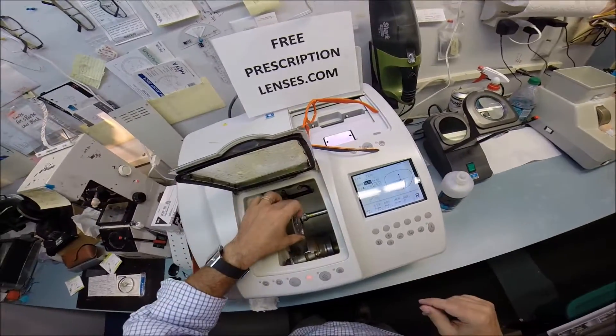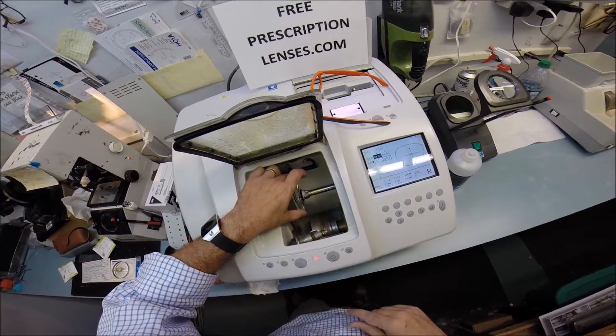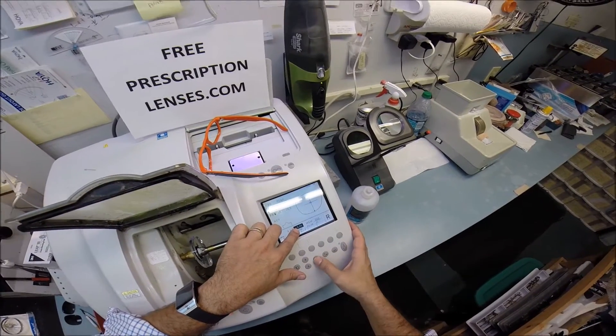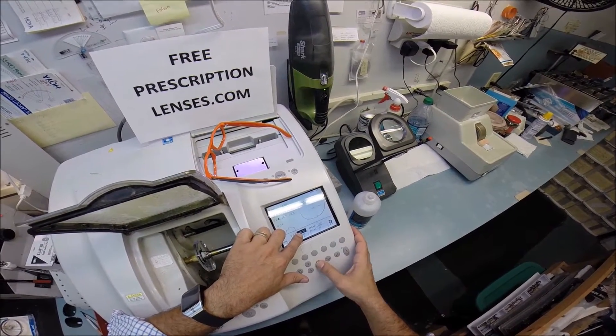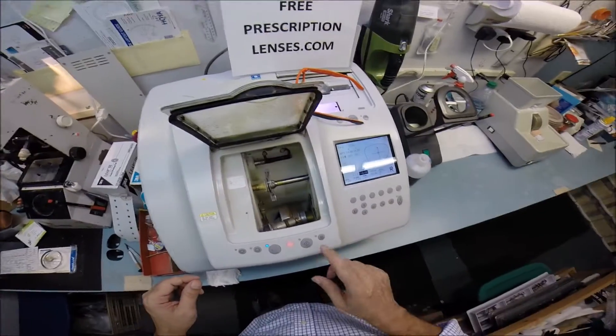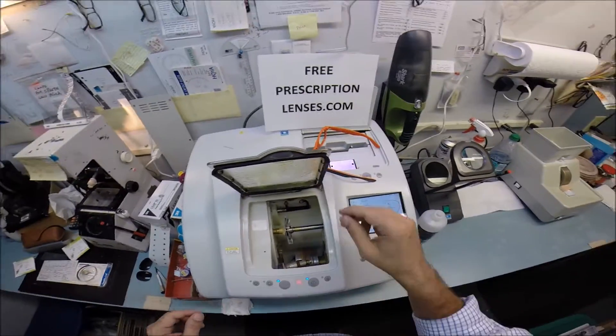So I'm going to take your right lens. Put it into the chuck. Now I know from experience that the 55 has a deeper bevel than the 52 that I'm wearing. So I'm going to take it down about half a millimeter. Now I'm hitting the start button.